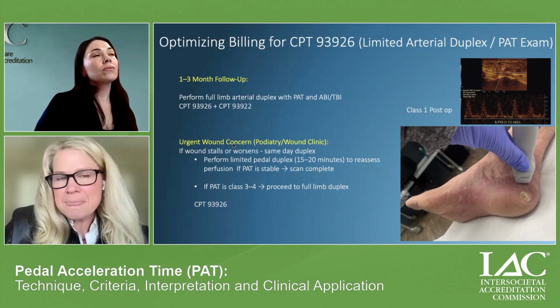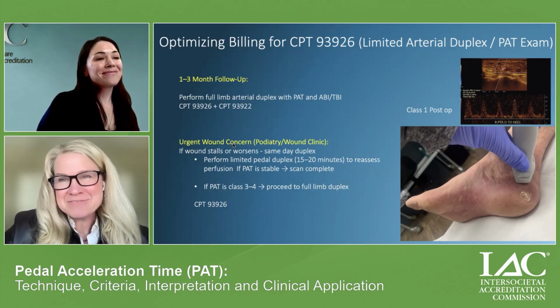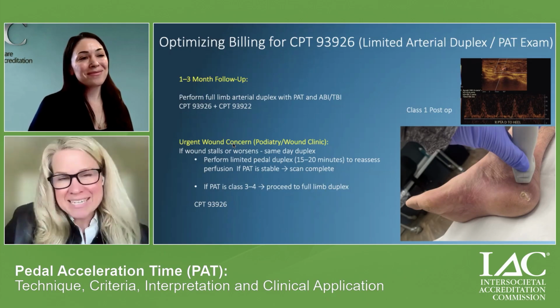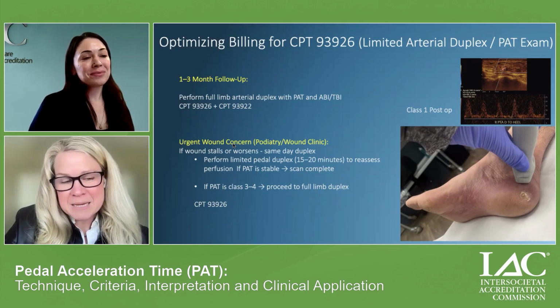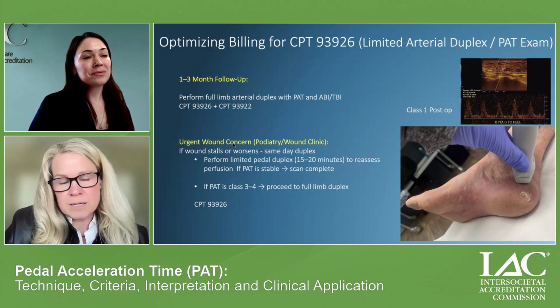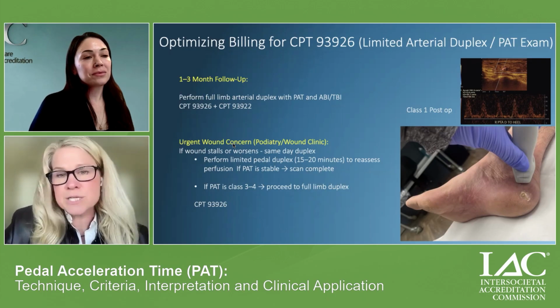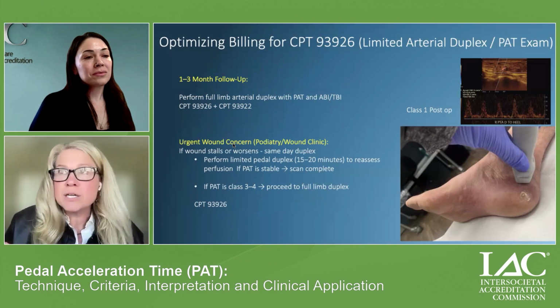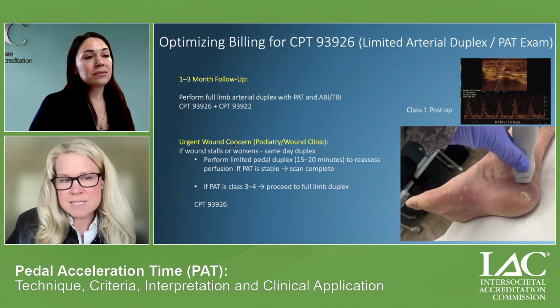And I will say, I hope you find joy in scanning the foot. I think it's really exciting from a vascular technologist perspective, and hopefully many of you will say the same thing. It's really nice to be able to share with our vascular colleagues that we now can say what the perfusion is like in the foot and give them more information on their decision making. Again, we are such an integral part of the multidisciplinary care for these complex patients.